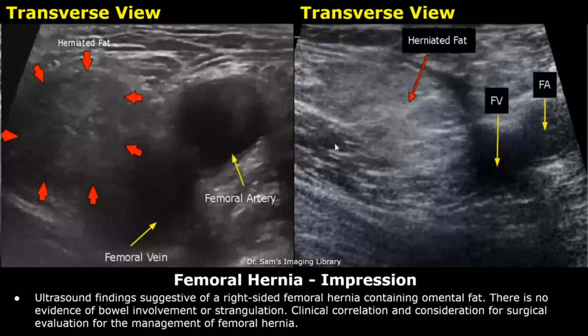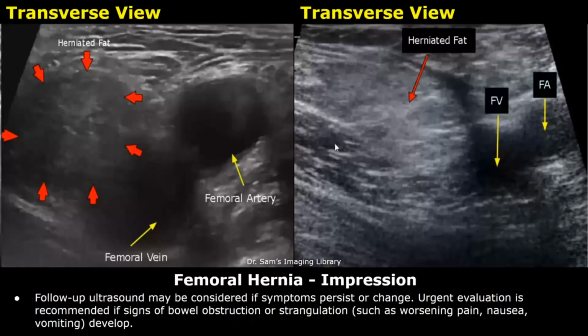Clinical correlation and consideration for surgical evaluation for the management of femoral hernia. Follow-up ultrasound may be considered if symptoms persist or change. Urgent evaluation is recommended if signs of bowel obstruction or strangulation develop.